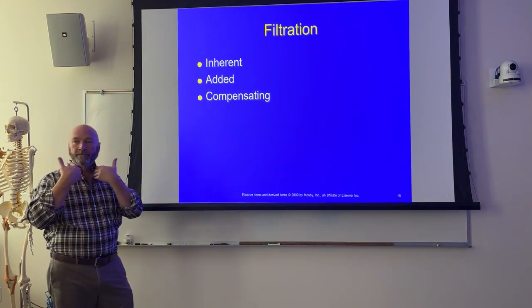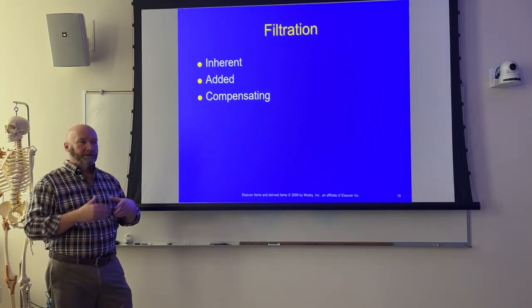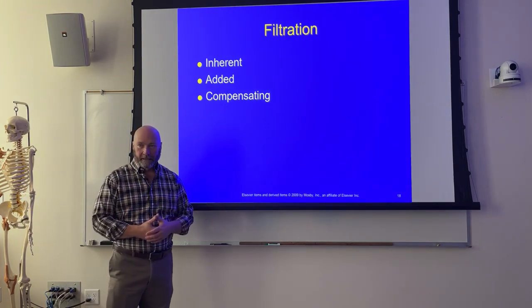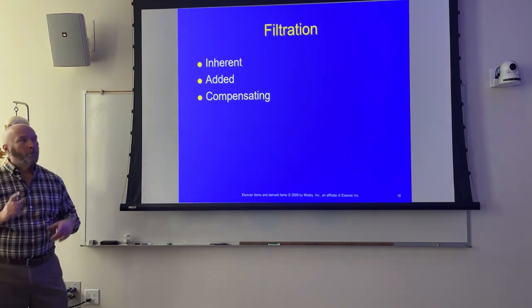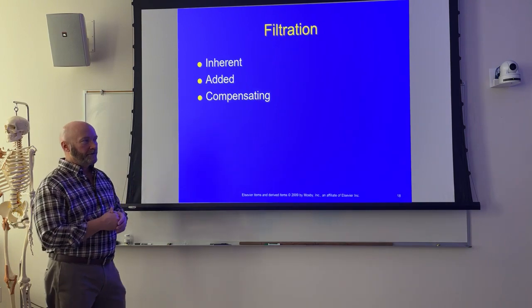I have fewer numbers penetrating through the top of that filter than what I did through the bottom, and as a result, it evened out the tissue density differences on the image. Don't really need that anymore because computer algorithm just magically takes care of that. Where you might see something similar to a compensating filter, it's not really compensating for anything.